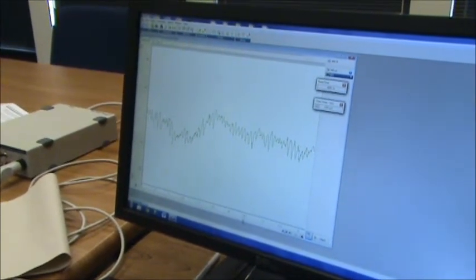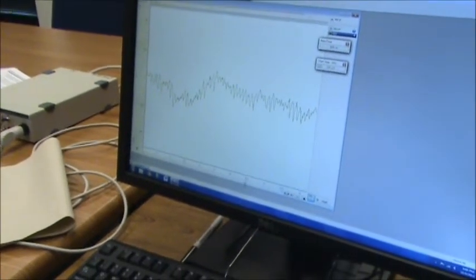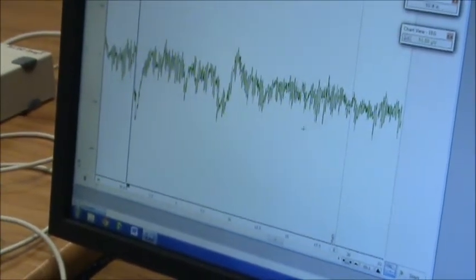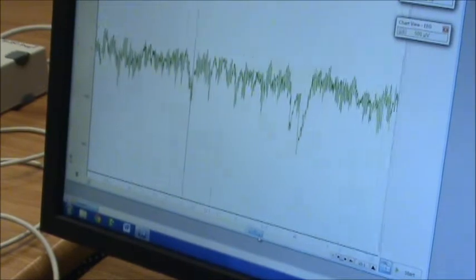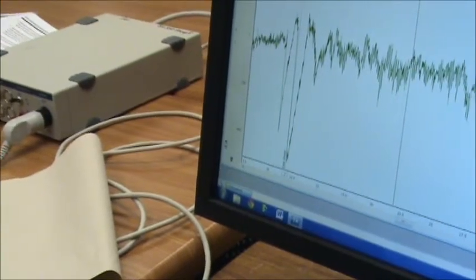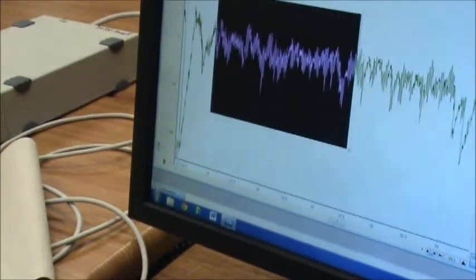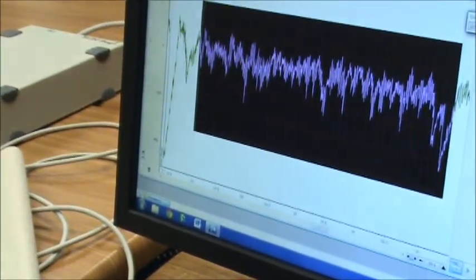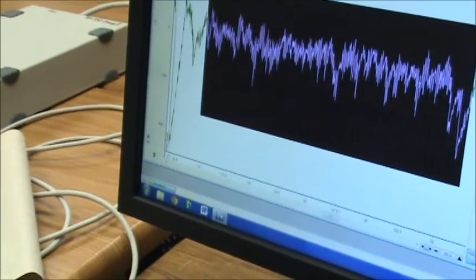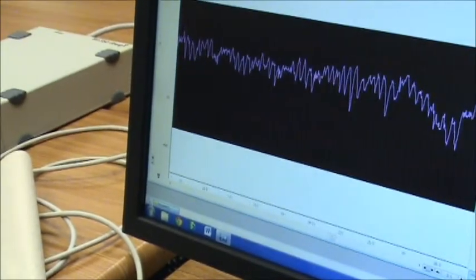Now that we're done recording we're going to analyze our data. It's easier to do if we compress it a little bit. With this compression you can see some patterns in the data. We're going to pick a part of the data to analyze — such as here where Ellen's eyes are closed. You can highlight some of the data and see patterns, and if you spread it apart you can see the frequencies more clearly.